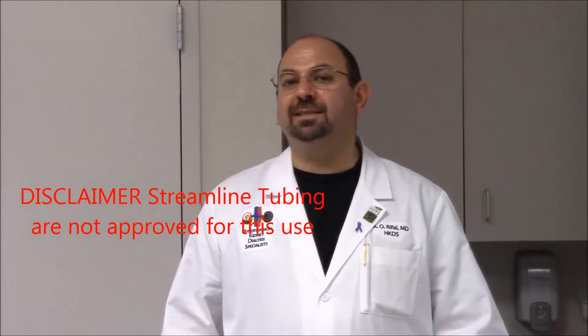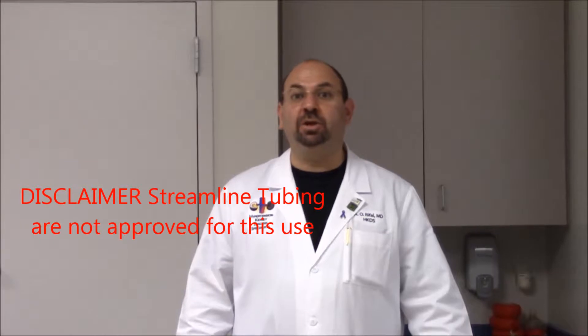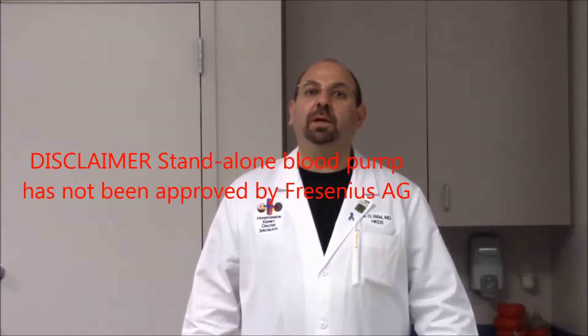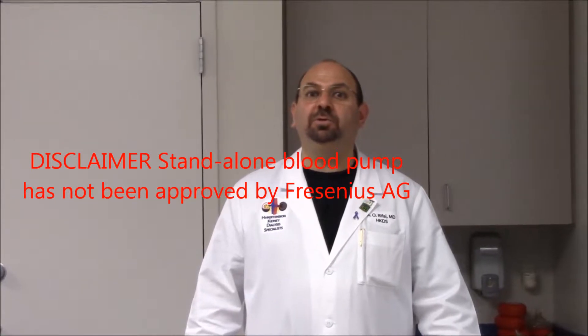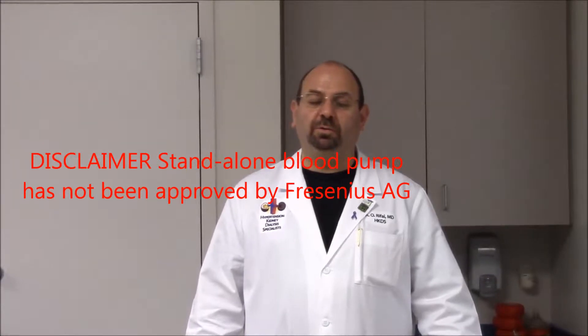First, a disclaimer. Any tubing we are using manufactured by NextStage — the Streamline set — has not been approved by NextStage for the purpose of this extracorporeal circuit. Also, the standalone blood pump manufactured by Fresenius has not been approved for this particular utilization, which uses an electrical voltage ranging between 9 to 24 volts. Both of these items have not been approved, and this is the disclaimer.